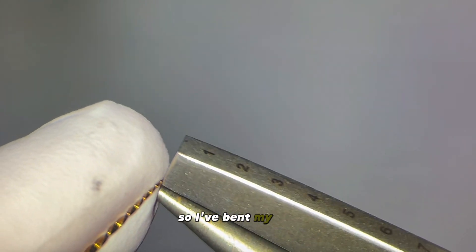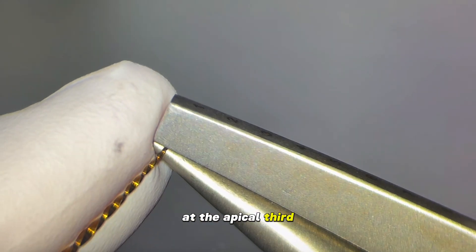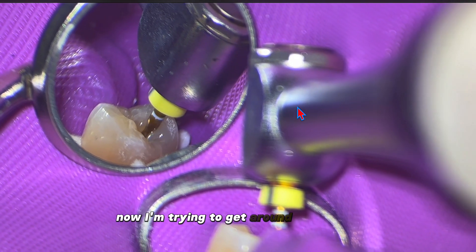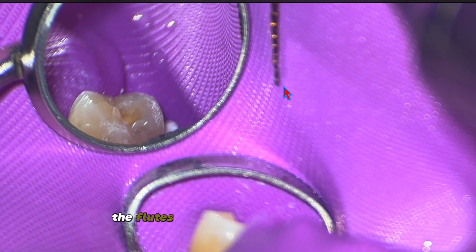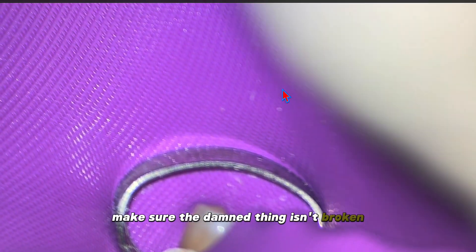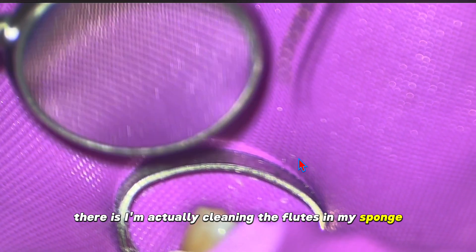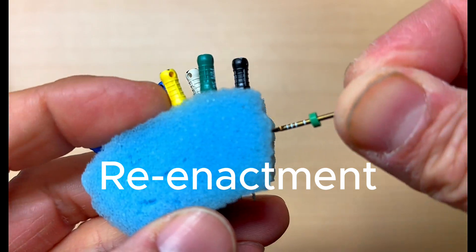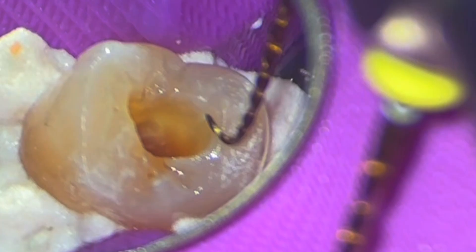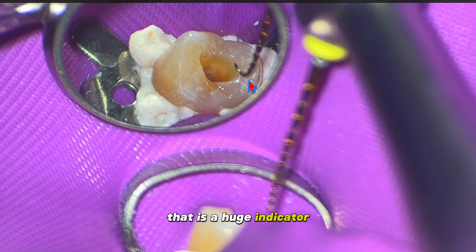I've bent my file at the apical third — the apical two millimeters — placed it to length, and hit go to get around that curve. I'm doing it in small increments, pulling the file out and checking the flutes to make sure there's no debris, and most importantly, making sure the thing isn't broken. I'm cleaning the flutes in my sponge. Then I bend the flutes and — look at what happens here. See this light pattern difference? That is a huge indicator.